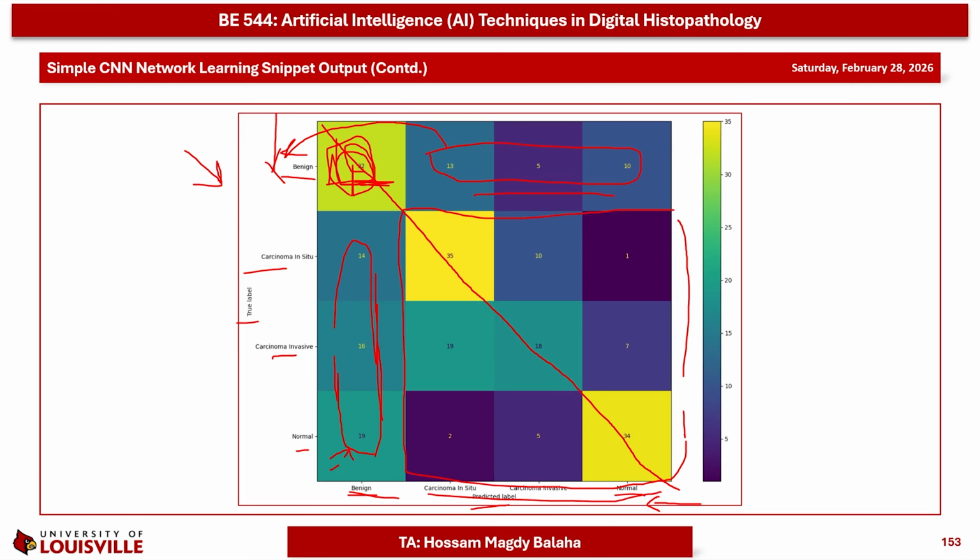We covered how to interpret the learning curves and the difference between fitted, underfitting, and overfitting. Also, we covered how to interpret the confusion matrix, and our aim in all of that is to get a model which is tuned with learning curves close together and reaching a settlement at a high value.